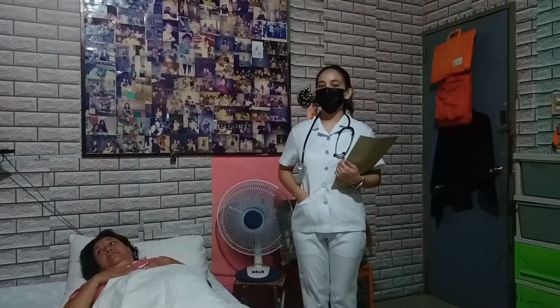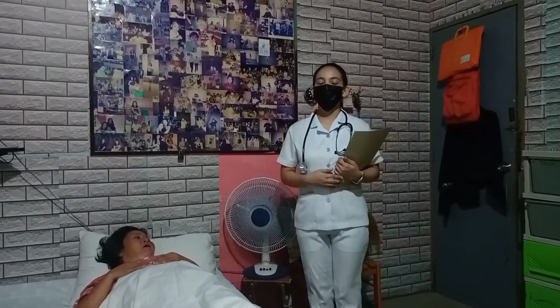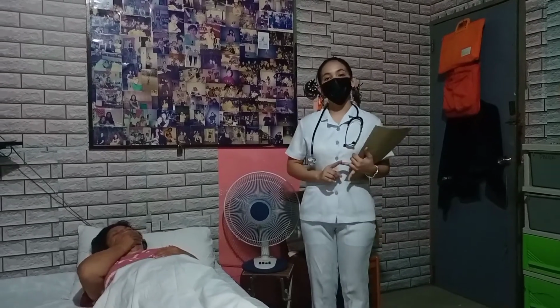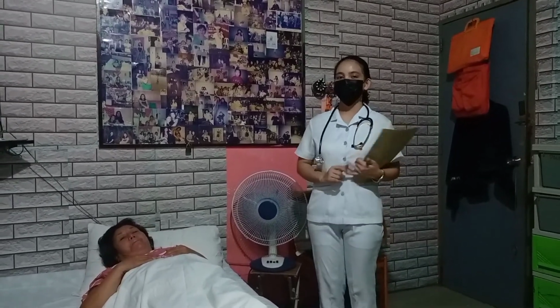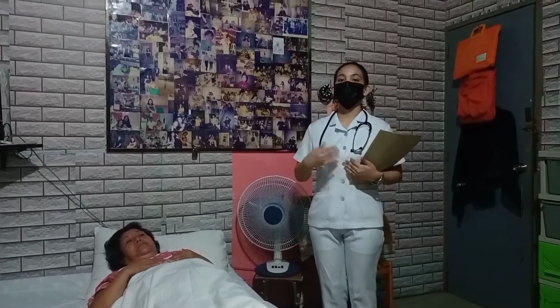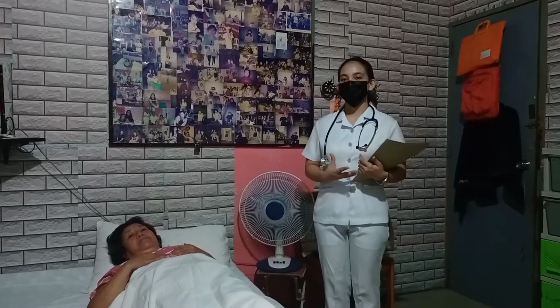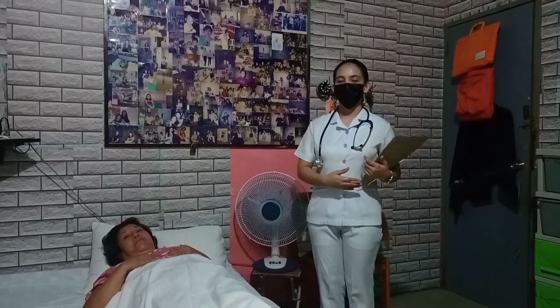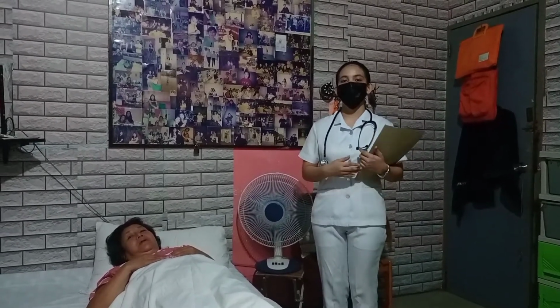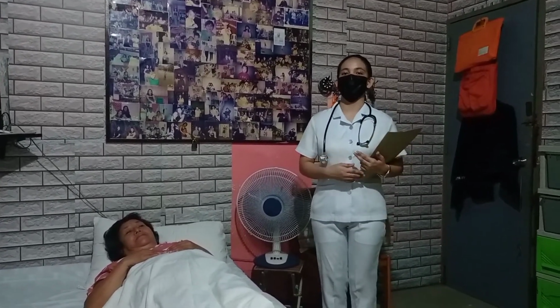Prior to performing the procedure, prepare all the equipment needed for the assessment, which are the syringe and the medication that you are going to inject into your patient. The rationale for that is organization regarding the medications. The next thing I'm going to do is check for discoloration or any abnormal findings before injecting the patient, which is the intradermal assessment.